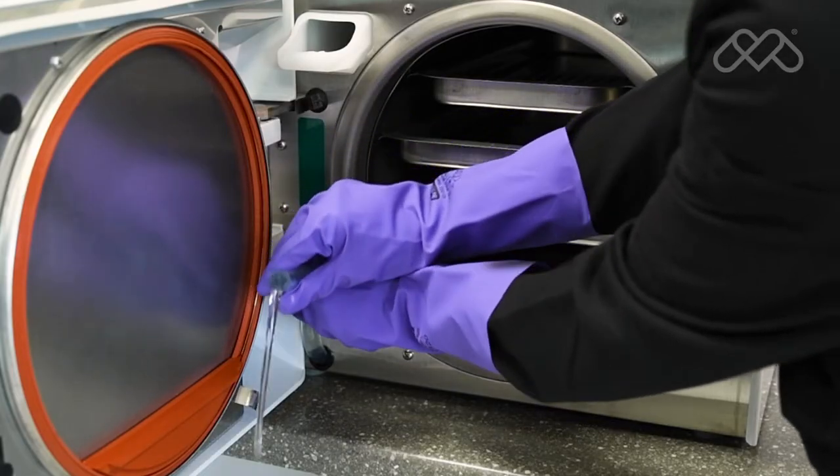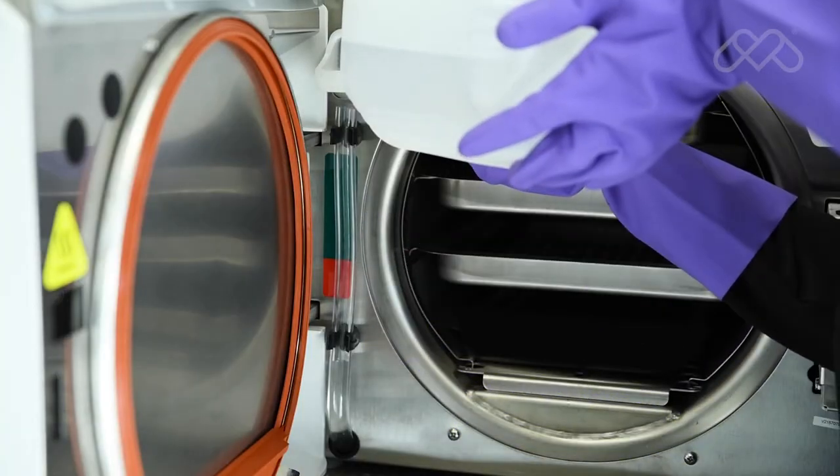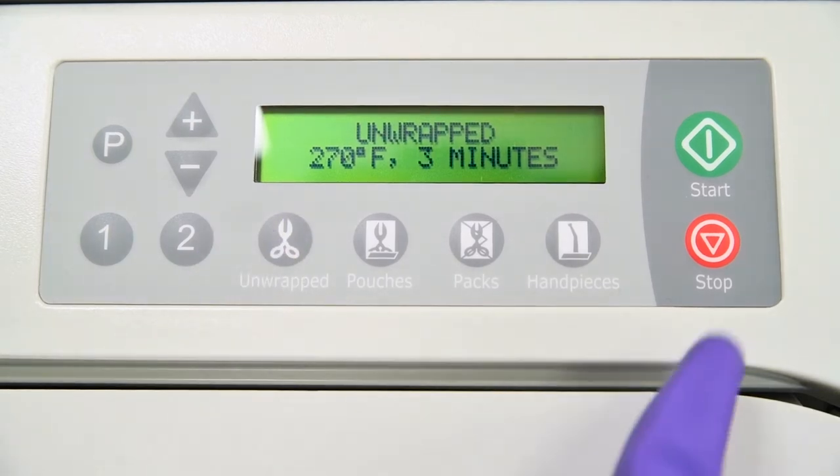Drain the reservoir again and refill a second time with clean distilled water for the rinse cycle. Rinse the chamber by running an unwrapped cycle. Push the stop button when the drying cycle begins.